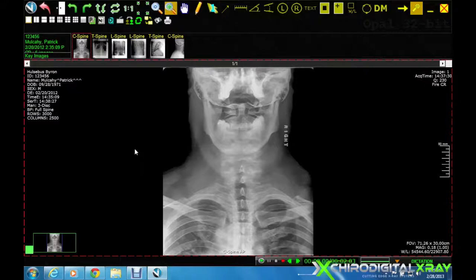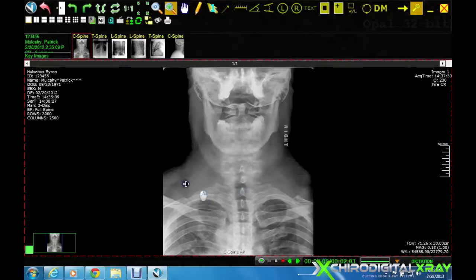There are a variety of tools at our disposal on the main toolbar. Some of the most commonly used tools include the window and level feature, which allows us to adjust the contrast and density of the image by holding down the right mouse button and dragging it across the image. The image quality of this film is fairly good.